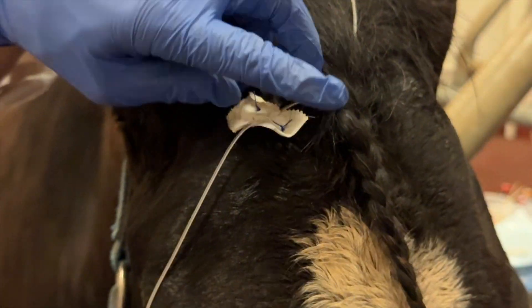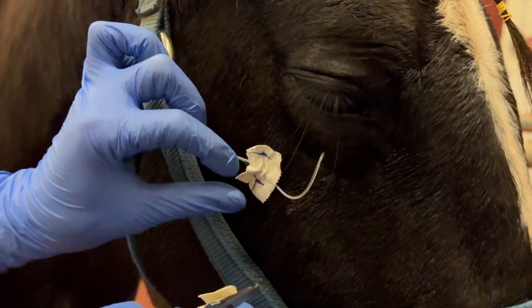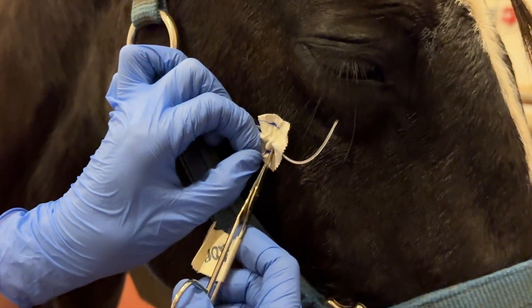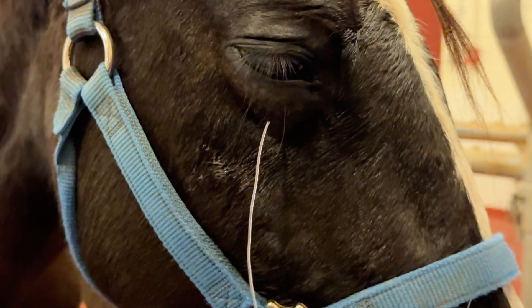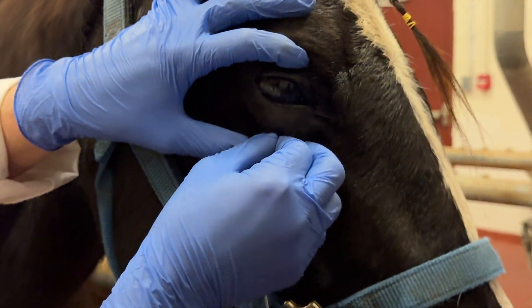You first remove the tape that is holding it in place on the head, and then cut the tubing with several inches to give you room to push it through the lower or upper eyelid that it is in place in.